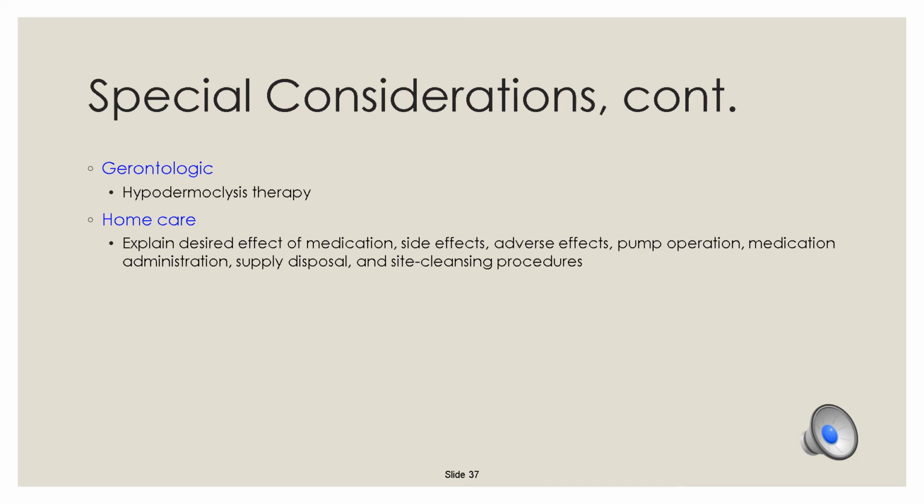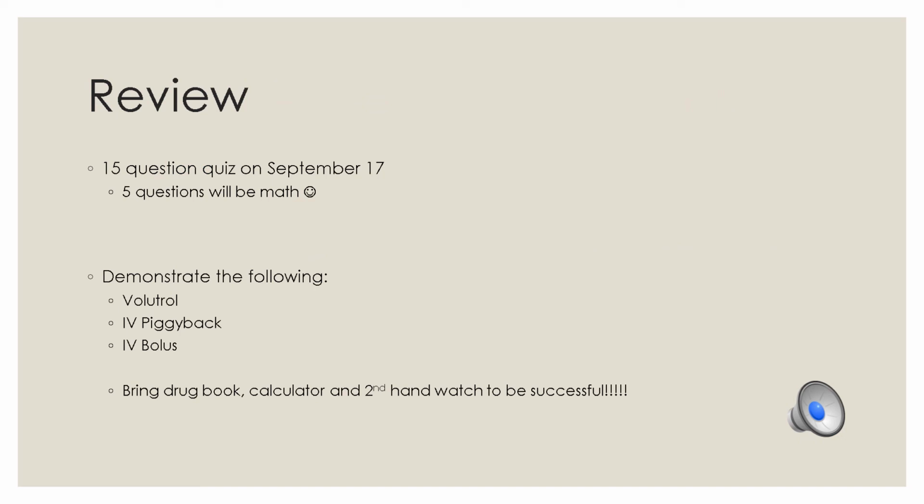In home care, we just need to educate. Patients may clean their site with antibacterial soap instead of alcohol and chlorhexidine to clean the insertion site. But education is key. And we made it to the end of the PowerPoint.